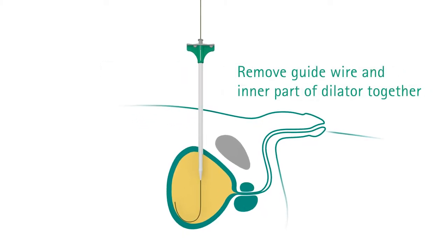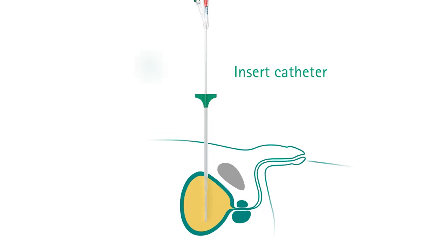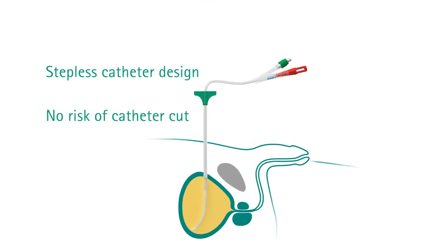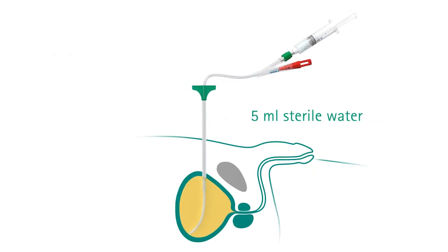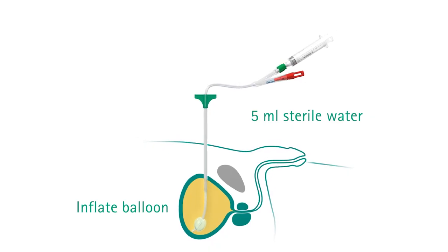Now withdraw the guide wire and the inner part of the dilator. The sheath remains in place in the bladder. Now insert the catheter into the sheath. More than half of the catheter's length should be inside the tube before you take the small syringe already filled and inject the 5 milliliters of sterile solution into the valve.